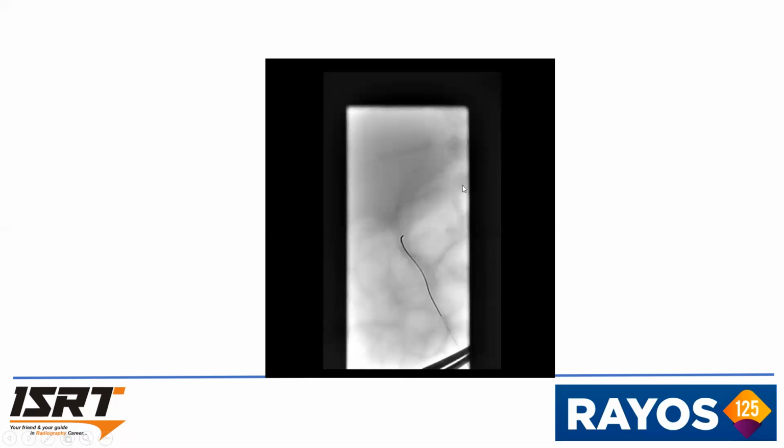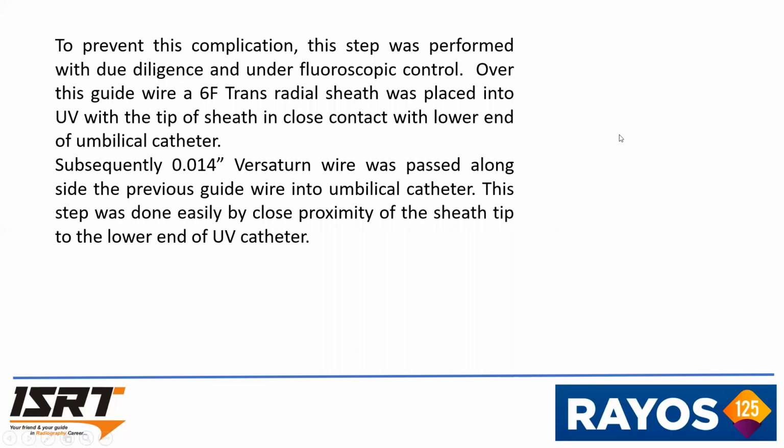You can see here it was going by the side and the catheter is sitting here. To prevent this complication, this step was performed with diligence and under fluoroscopic control.